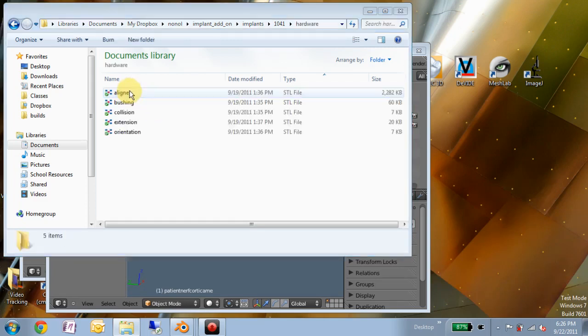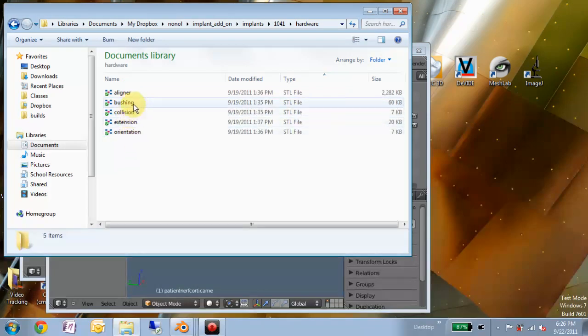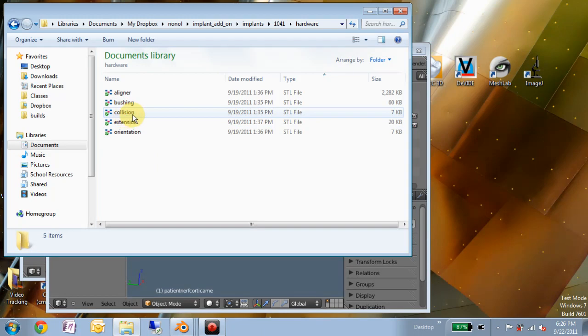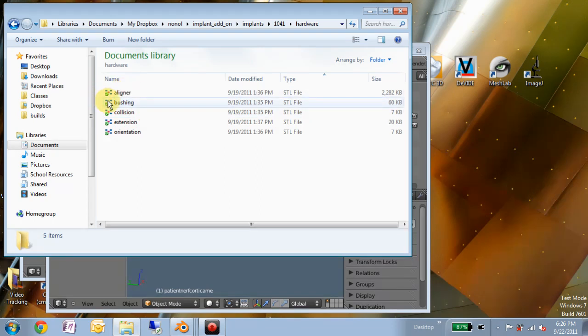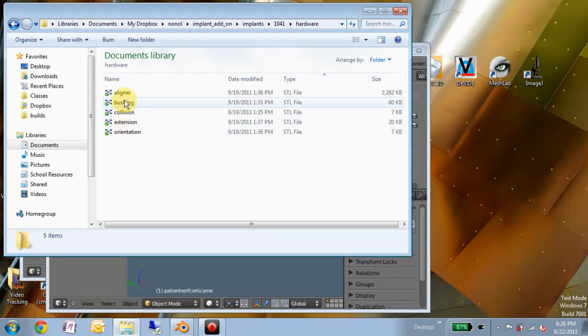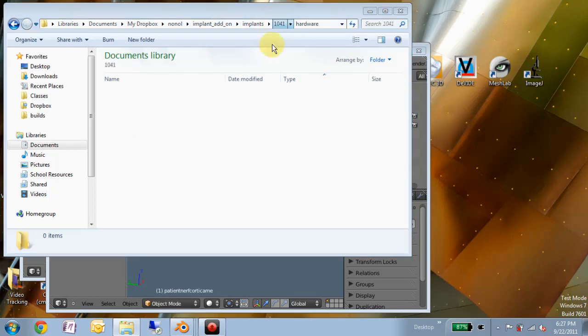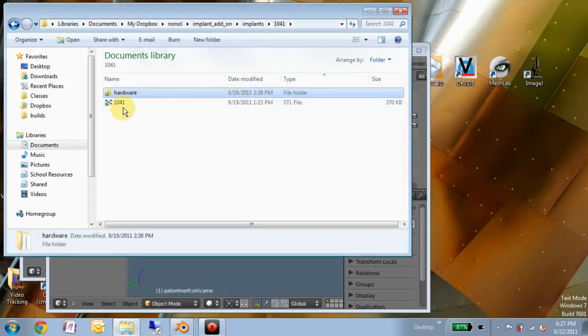And then a separate folder representing all the associated hardware, be it collision, which represents a safety region around the implant, and then an aligner or coping or custom abutment or the bushing, which you would use to put into a surgical guide to limit the depth that your osteotomy burrs might go. So this is just a proposal in terms of how this could be organized.